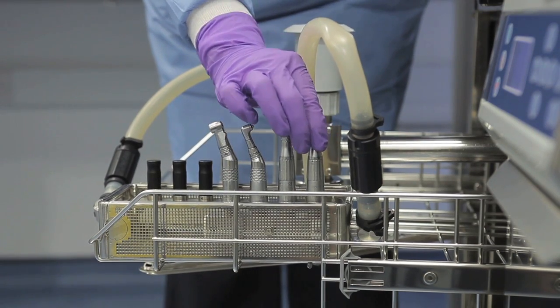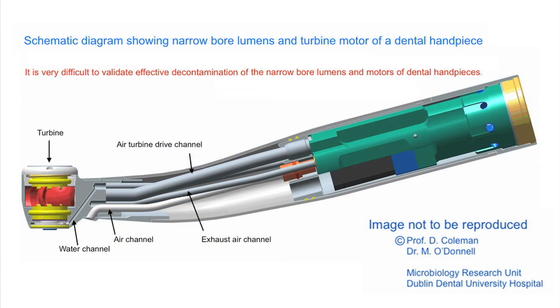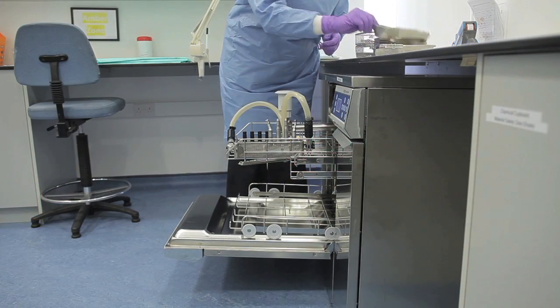Automated thermal disinfection of dental handpieces using a validated protocol with a washer disinfector is the preferred method of dental handpiece decontamination prior to sterilisation. Due to their complex interior design, including the presence of narrow lumens and channels, dental handpieces should preferably be processed through a washer disinfector equipped with dental handpiece adapters, as per the specifications of the manufacturers. New washer disinfectors should have adapters for dental handpieces as standard.